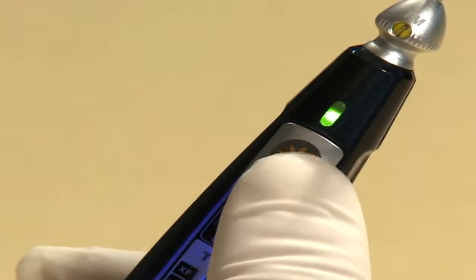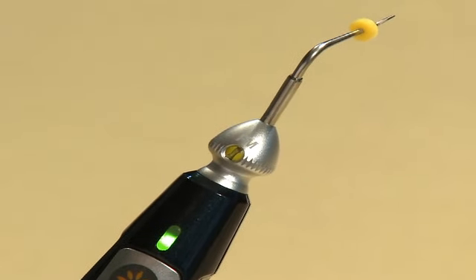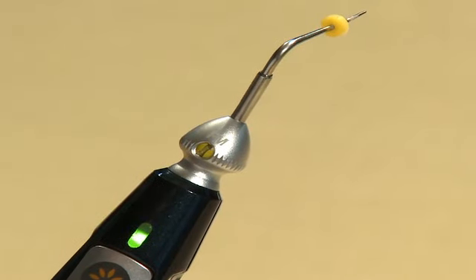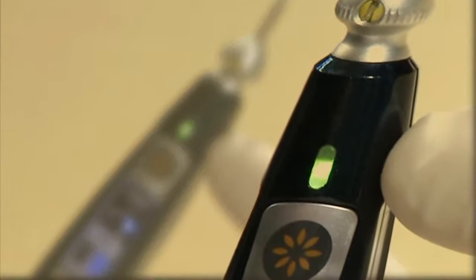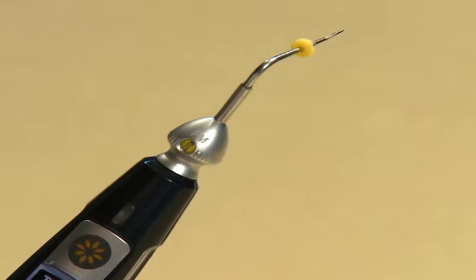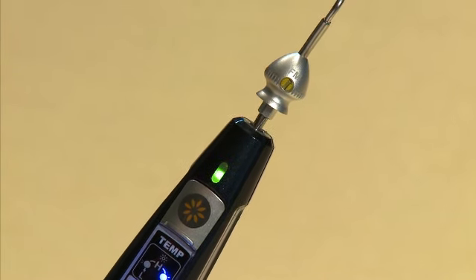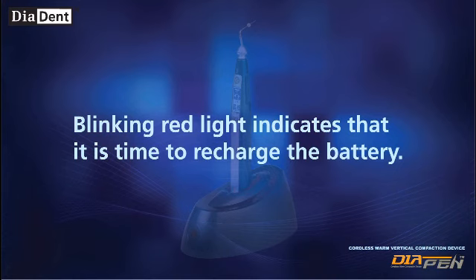A beep will sound to signal that the tip is heating up. The indicator above the operation button will light up when the tip is heating up or cooling down. Green light indicates that the tip is inserted in the handpiece correctly and that the temperature is below 100 degrees Celsius. Blinking green light indicates that the pen tip is overheated or that the tip may not be inserted into the handpiece correctly. Red light indicates that the tip is activated. Blinking red light indicates that it is time to recharge the battery.